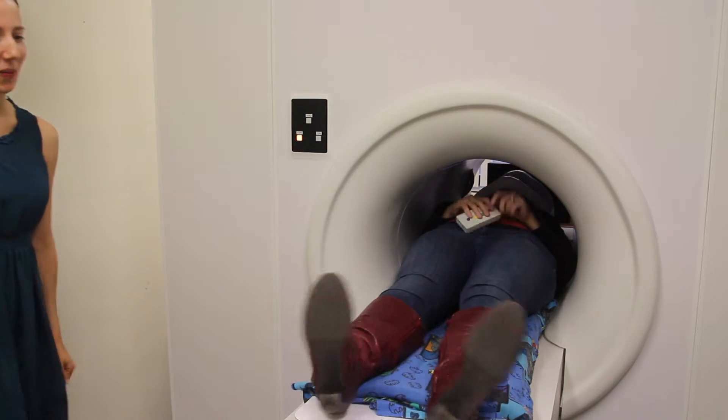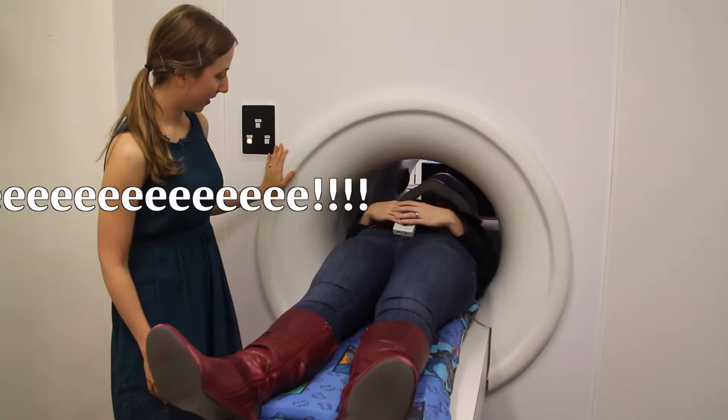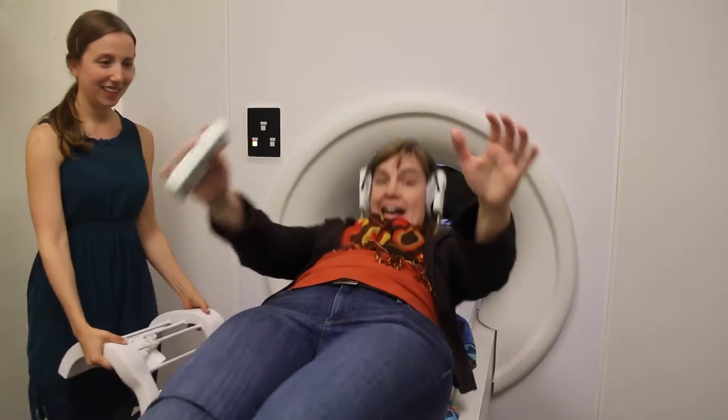Still doing okay in there? Yep. Are you ready to come out? I am. I'm going to take this part off for you, keep him up the mask, and you can sit up. And you are all done. Great success.